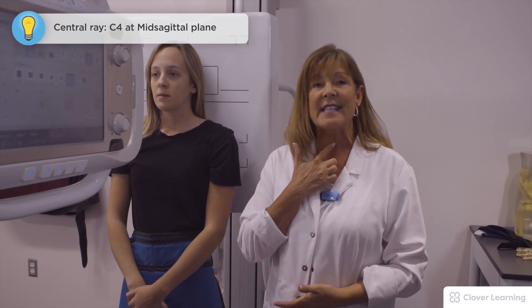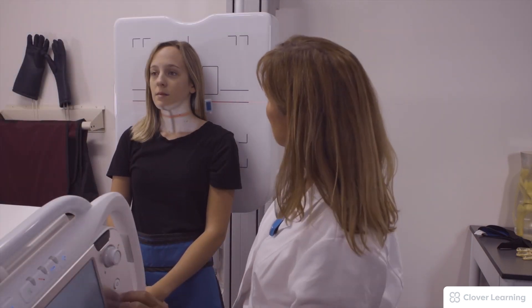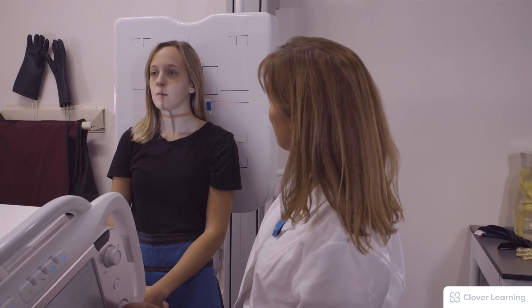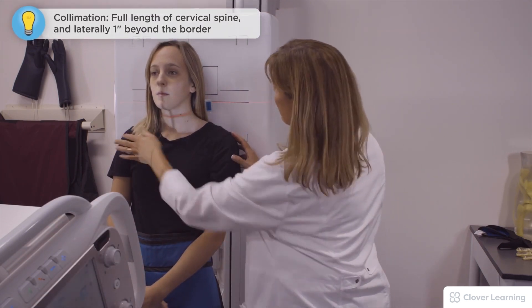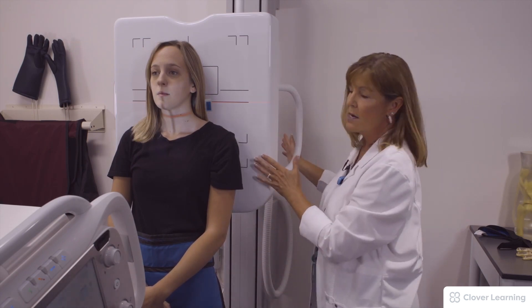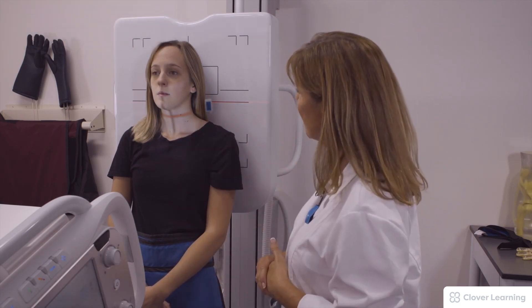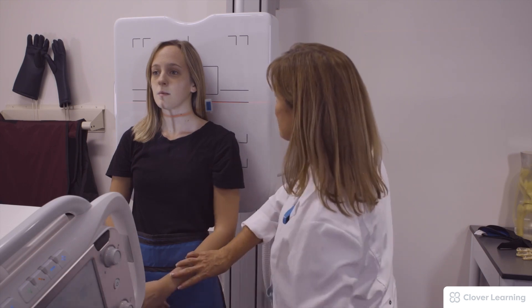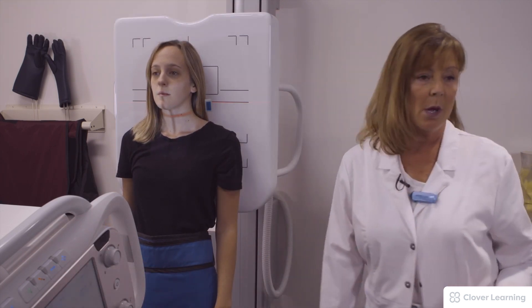We are going to add a 15 degree cephalic angle and center at C4 in the mid sagittal plane. We're going to collimate from side to side with a right marker, centered to the IR. We have a 15 degree cephalic angle centered at C4. The patient will hold very still.